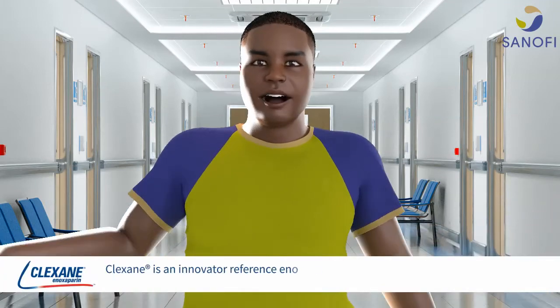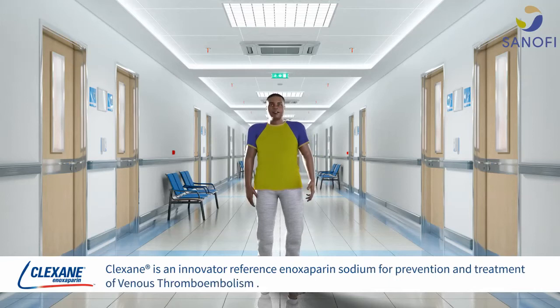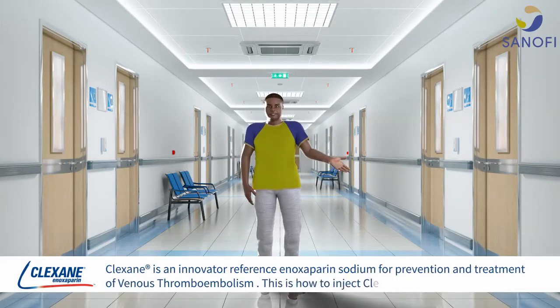Clexane is an innovator reference enoxaparine sodium for prevention and treatment of venous thromboembolism. This is how to inject Clexane.